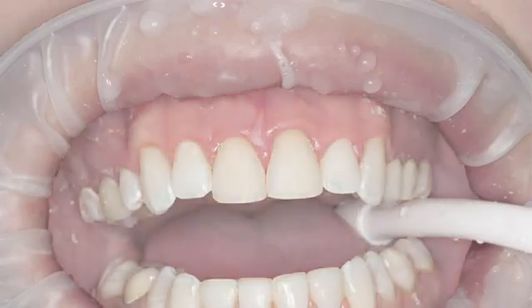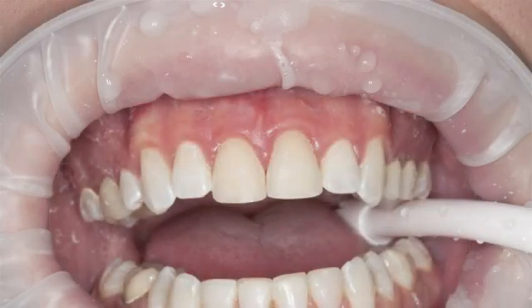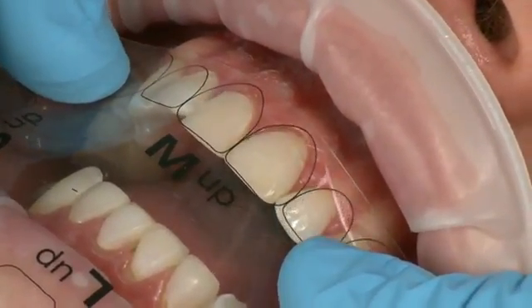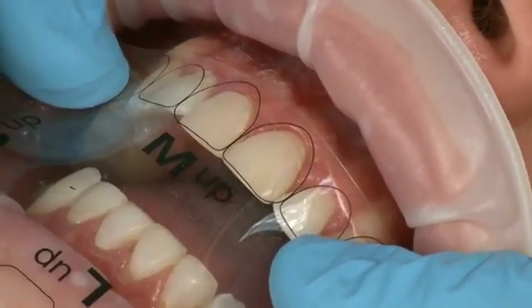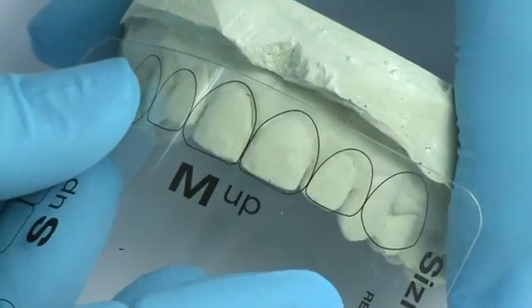During the procedure, the clinician must maintain proper isolation of the operative field. To determine the correct Edelweiss composite veneer size to be used, place the Edelweiss sizing guide over the patient's teeth. This can also be done prior to the appointment on a stone model.